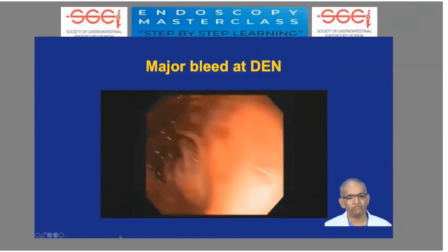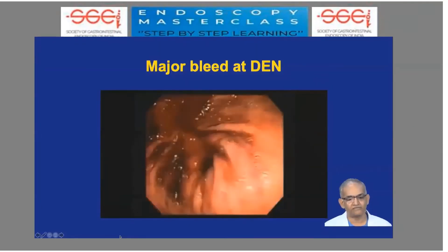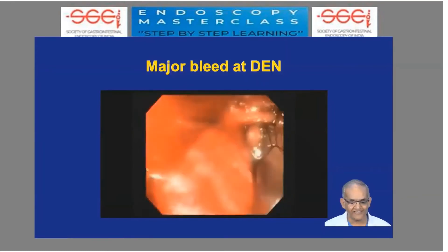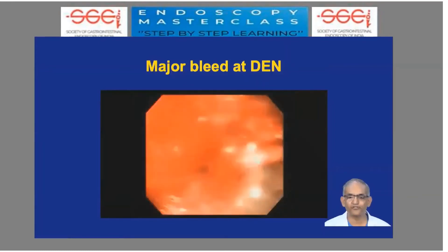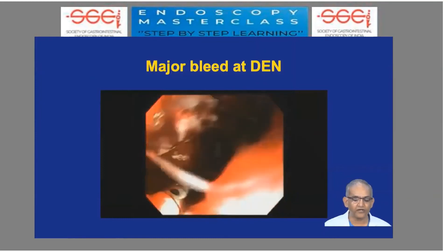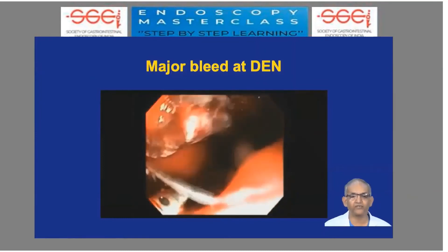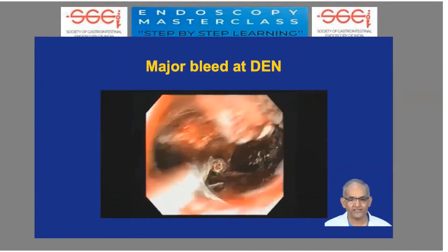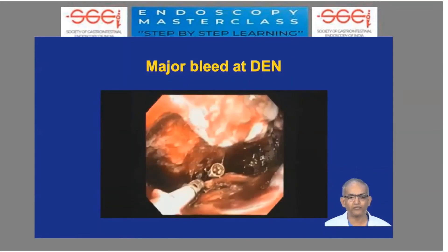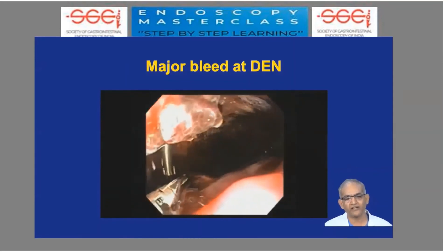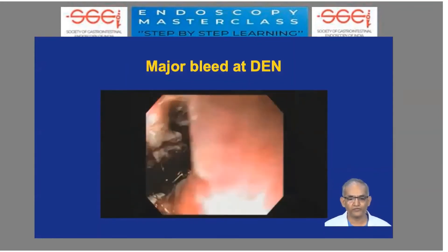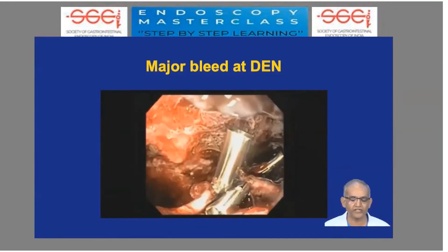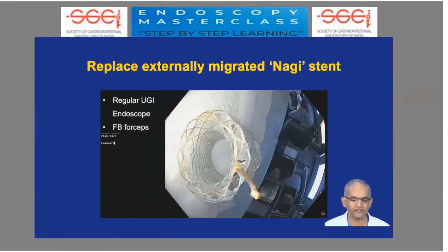This is an example of an arterial bleed visible inside the cavity. Some gastroenterologists with the confidence will go inside and put clips on these blood vessels. Personally, I prefer to ask IR colleagues to bail out from this situation, but it all depends on what resources are available at your center.